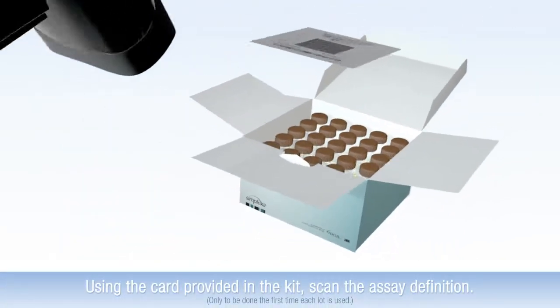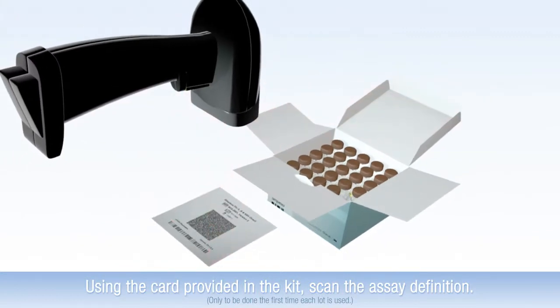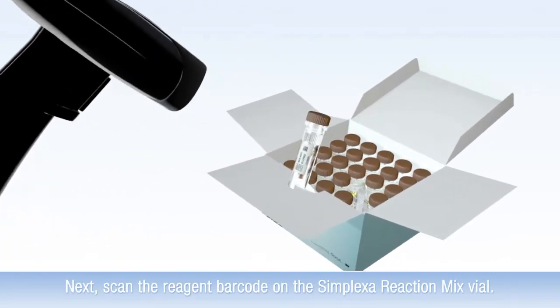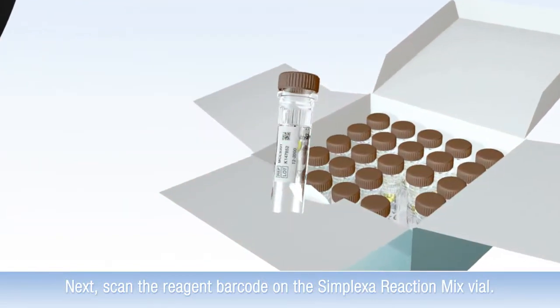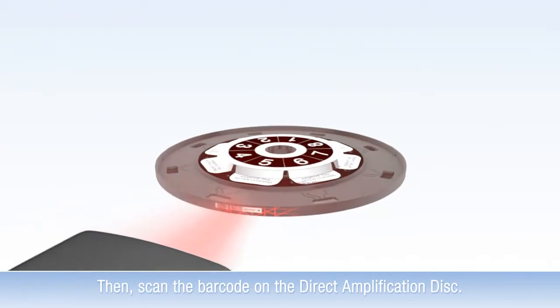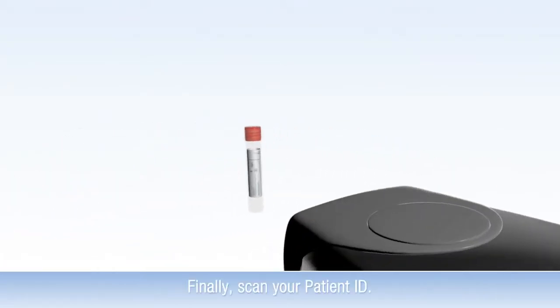Using the card provided in the kit, scan the assay definition. Next, scan the reagent barcode on the Simplexa Reaction Mix vial. Then, scan the barcode on the direct amplification disk. Finally, scan your patient ID.